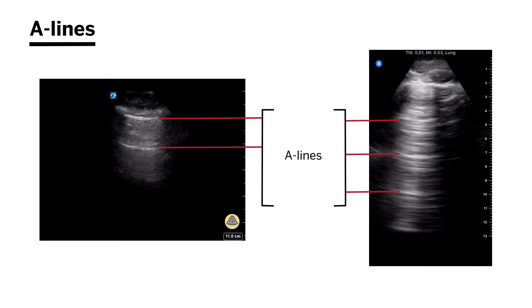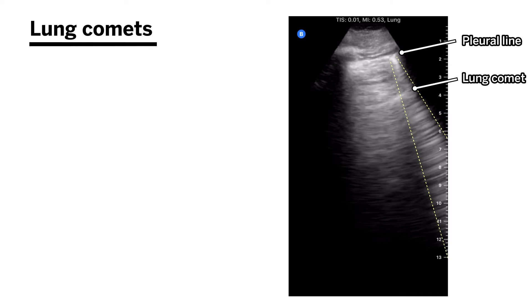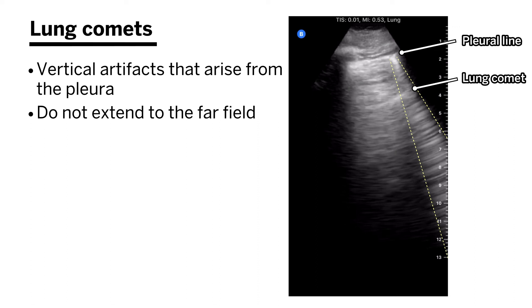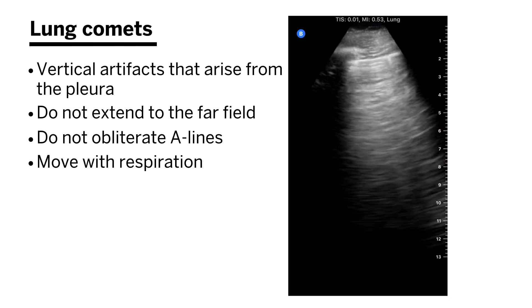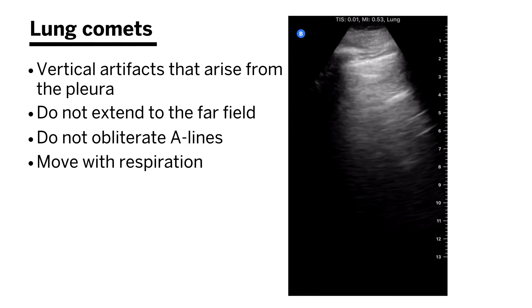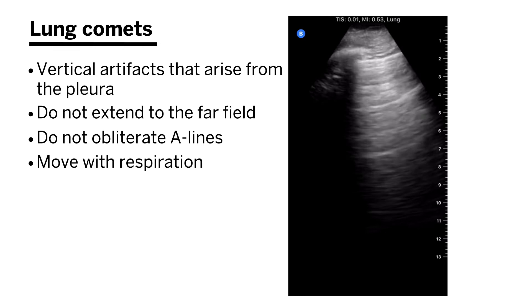Next up is lung comets. Lung comets are vertical artifacts that arise from the pleura but do not extend into the far field of the image. They represent little irregularities in the pleural line that cause artifacts as sound traverses them. These artifacts don't go all the way into the far field, do not obliterate A-lines, and do move with respiration — differing from B-lines in those ways. They are fainter than B-lines and are hard to see without the linear probe. Lung comets are a normal finding and a good indicator that pleura is apposed to pleura.